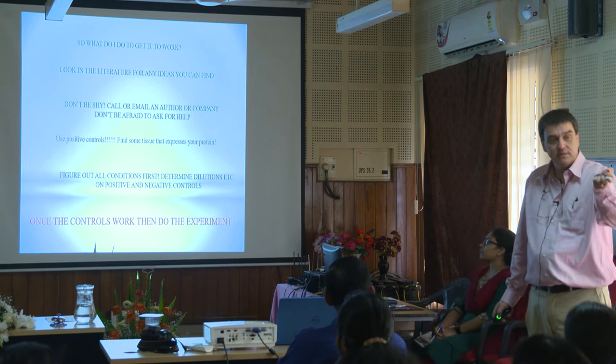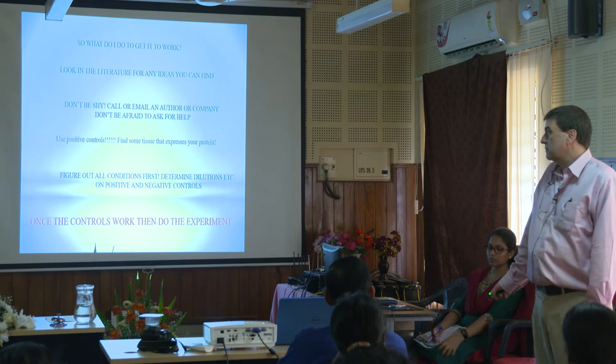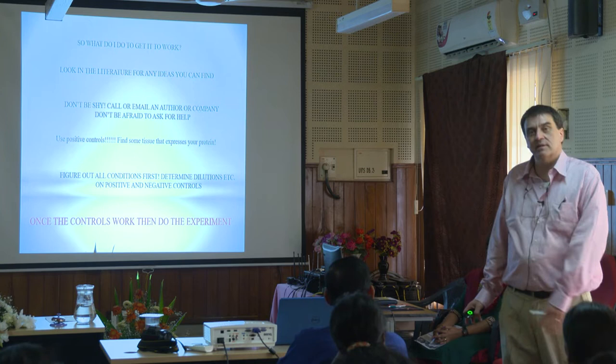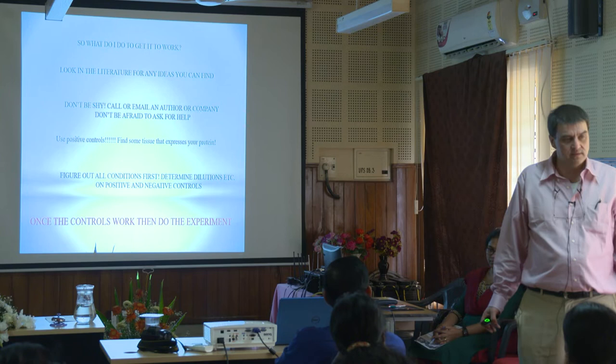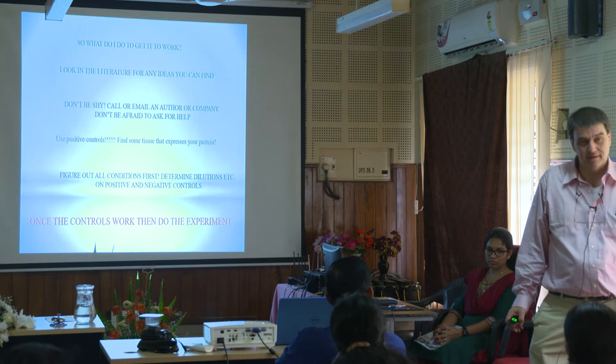Like your boss wants you to do 4 time points with 6 different dilutions of a drug. A lot of people come to my lab with the 4 time points. They spend hours and days on this, and they'll do the 6 different dilutions of the drug. They'll come over with 20 slides, 40 slides. I'll put the first slide out and say, it didn't work. And they'll look at me and go, what do you mean it didn't work? I said, it didn't work. Well, look at the next slide. I'll look at the next slide. Didn't work. Look at the next one. Didn't work.